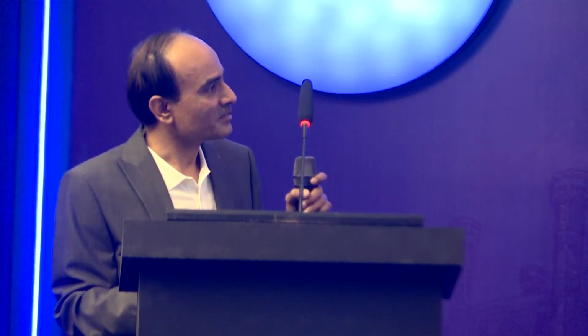Yeah, that's a great thought. This was my thought as well. So immediately I asked the operator to look at the trolley and look at your balloon. We also washed it up, and we saw the distal tip of the balloon was missing. That was the perfusion balloon, and I think it was perforated, because this no flow remained for 12, 14 to 15 minutes, and they had to use it 2-3 times for delivering the drug, so it was probably not robust enough to withstand that.